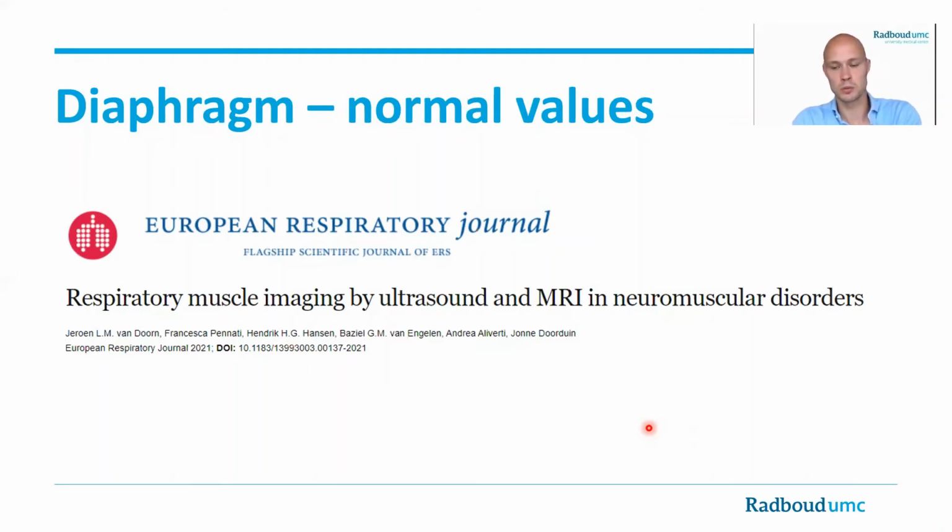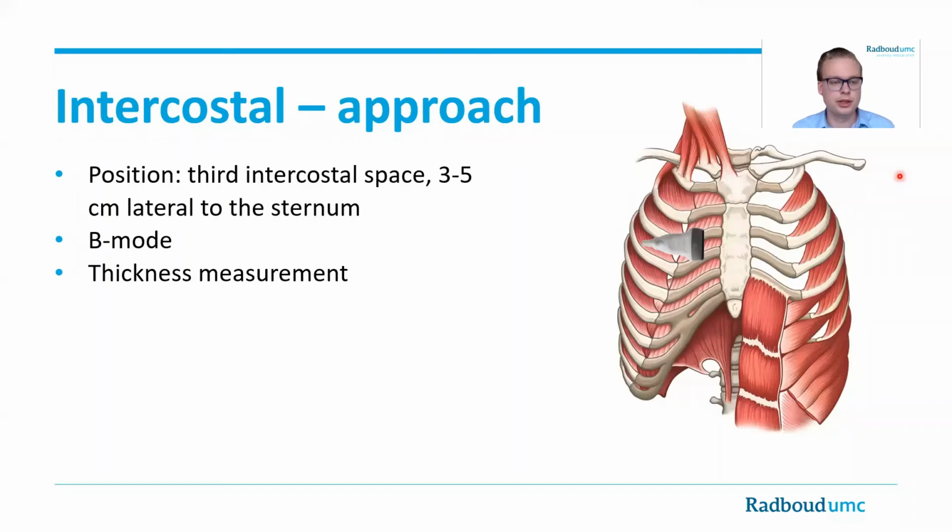So now I'm ending this diaphragm scan demo, and my colleague Jonne Doorduin will continue with the presentation. Thank you. I will be covering the accessory respiratory muscles, of which I'm going to cover the intercostal muscle first.